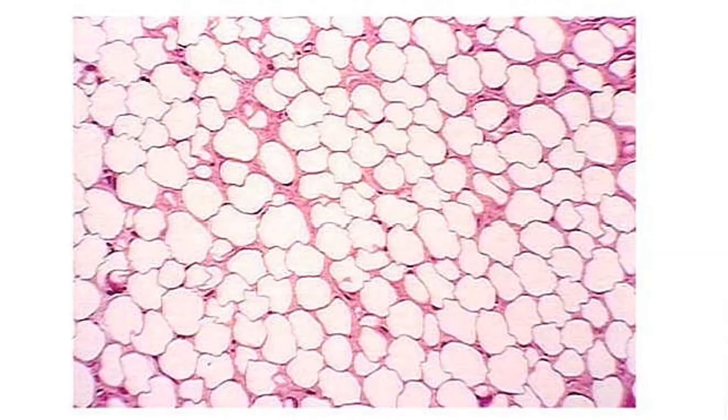Aha, big white bubbles. Big white bubbles is adipose, right? So much fat inside of these cells, lipids, that the nuclei is shoved over to the side. So specific type is adipose, connective tissue. Function, store fats, store energy. Could be cushion or insulation as well. Location, body fat, wrapping around some organs.